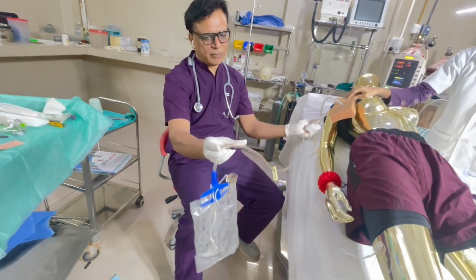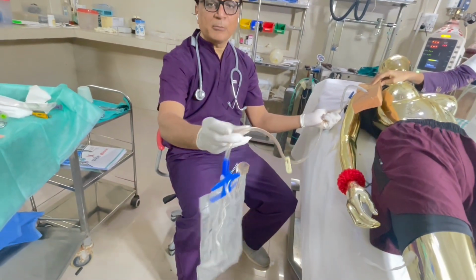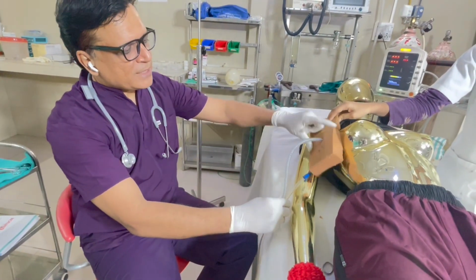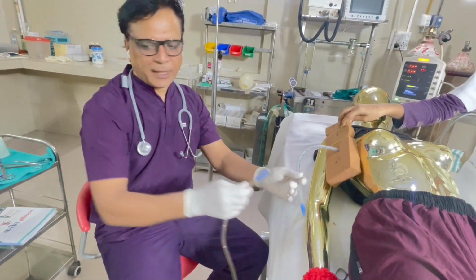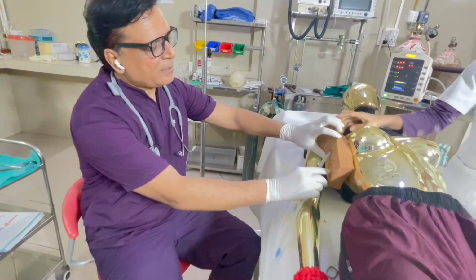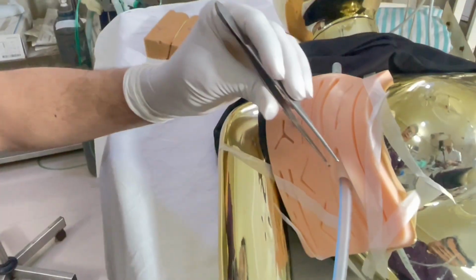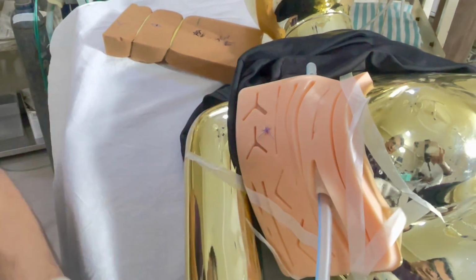Once the column is moving or you see some bubbles and there is no blood or hemothorax inside, you are 100% sure that it is inside the cavity. Once it is inside the pleural cavity, then the drain has to be fixed. How to fix the drain? The drain is actually inside the chest. Now how to fix the drain?